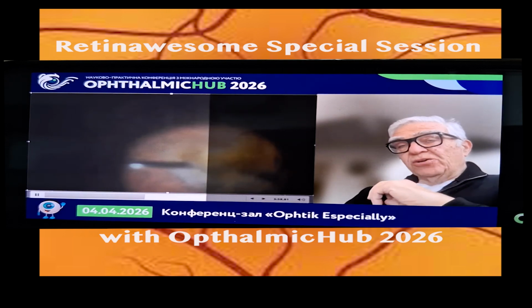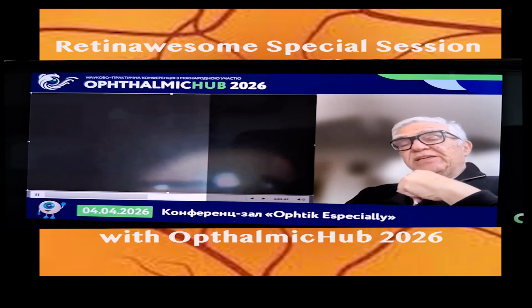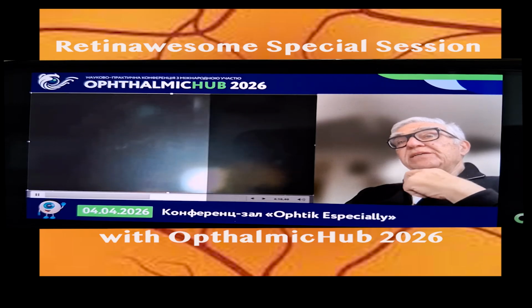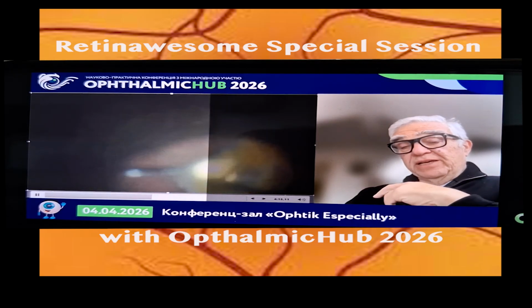So the end of your probe that is doing phacoemulsification inside the eye should never leave the nucleus unless it's stopped. You cannot suck BSS while you have this thing.